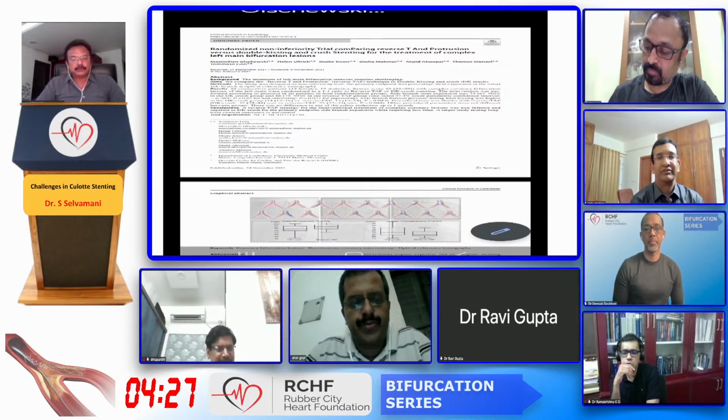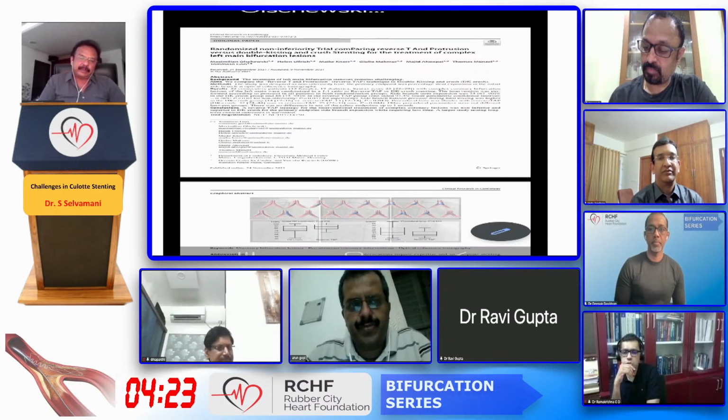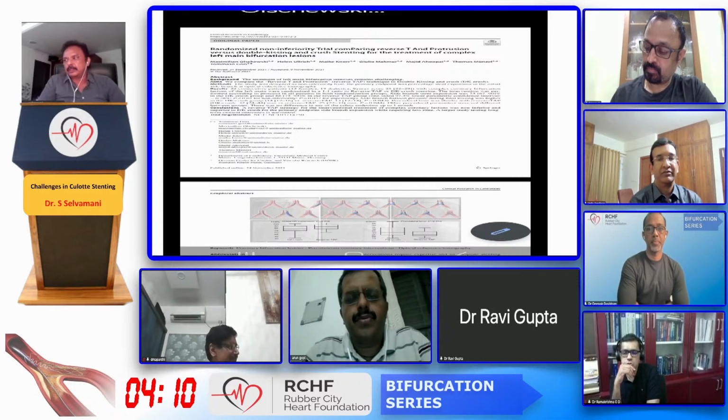What would you do? So many times what we do is, we try to do a POT-like procedure there. If there is a significant amount of struts into the left main hanging there, take a bigger balloon and dilate, that is more ideal. But if it's a very short segment, like 1 or 2 struts, I think we cannot do anything. We can just leave it level.